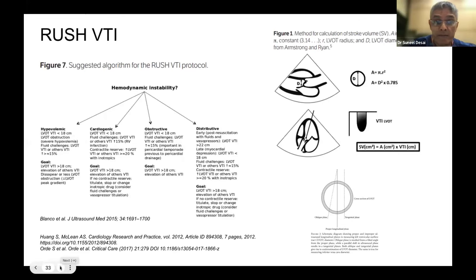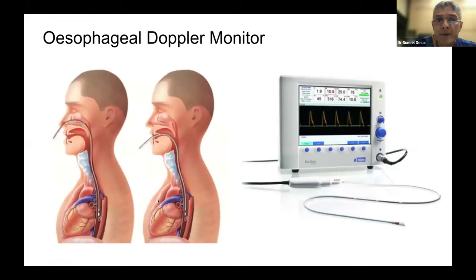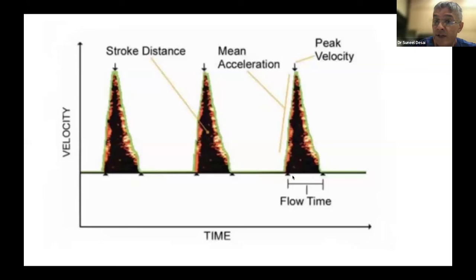Very easy, very quick. Now, can you use other arteries? Well, we know that there has been a previous machine, the esophageal Doppler machine, that's still in use. And there's a non-invasive version of this called the USCOM, ultrasound cardiac output monitor, that allows you to put it on the aortic area, the pulmonary area, or the suprasternal region as well. And it'll give you pretty similar numbers, both cardiac output and a magic number called flow time or left ventricular ejection time. It also can calculate the area of the upstroke between the onset of systole or aortic ejection and peak velocity here. So the gradient of this is a marker of LV contractility or rate of rise or dP/dt max. The ejection time is inversely related to systemic vascular resistance or excess afterload.